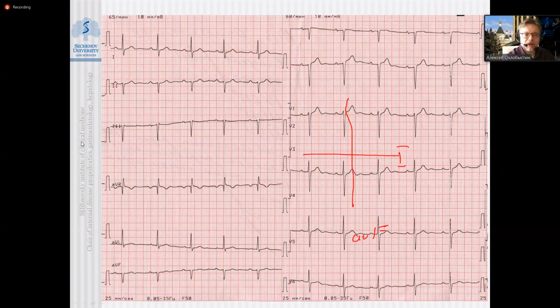And pay attention, we have positive in first, but we have in AVF negative, and therefore it should be, in that case, in this quadrant. Then look precisely inside at what's happening to the negative part of third or positive part of AVL, like this.